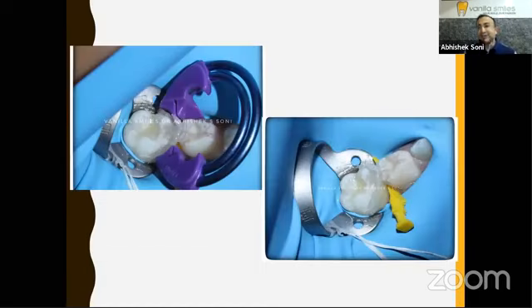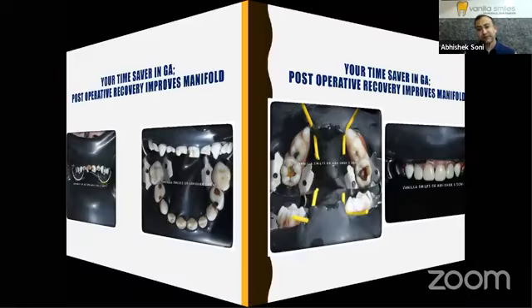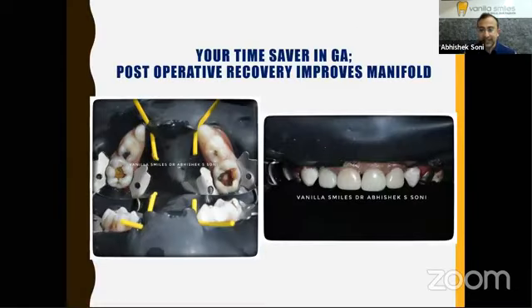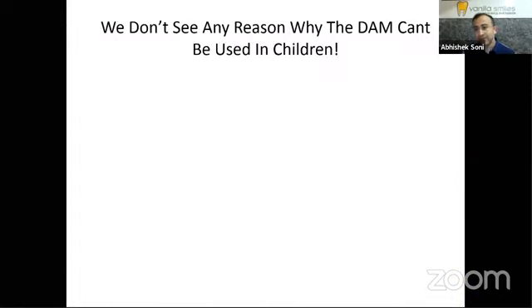And you are able to give quality dental care, not just chairside, but also under general anesthesia, where a complete arch isolation will eventually save at least 20 to 30 minutes of your time in the OR. So Dr. Sanchit and I both feel that we don't see any reason why the dam cannot be used in children.